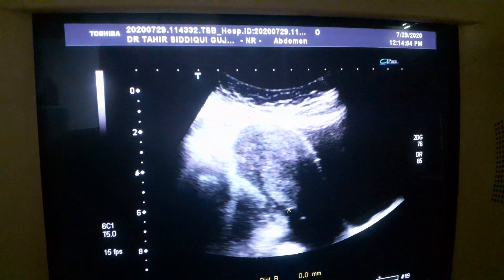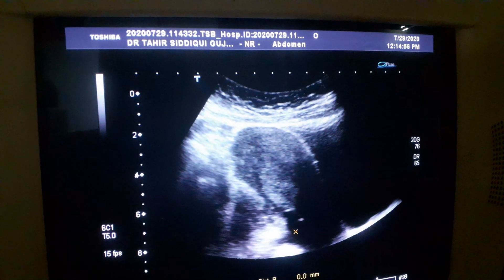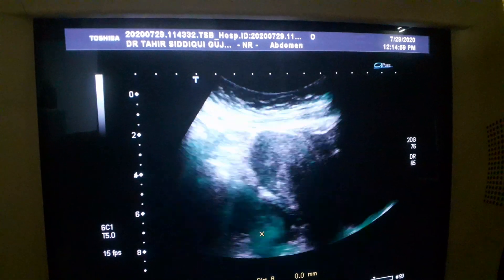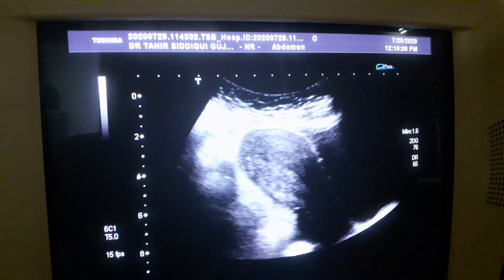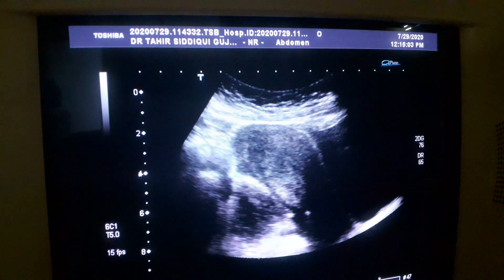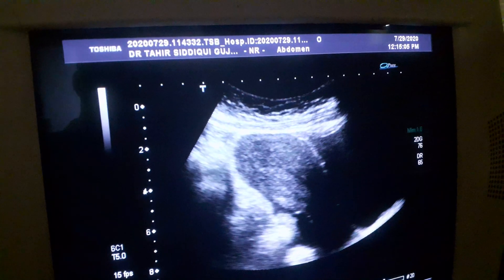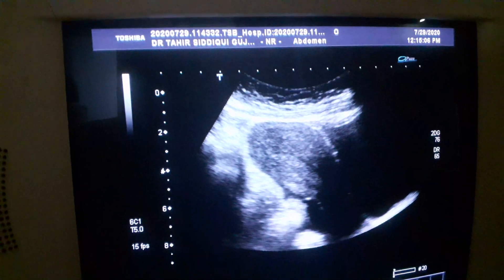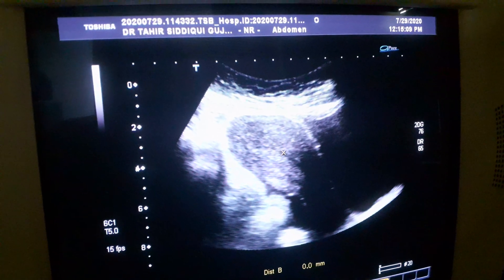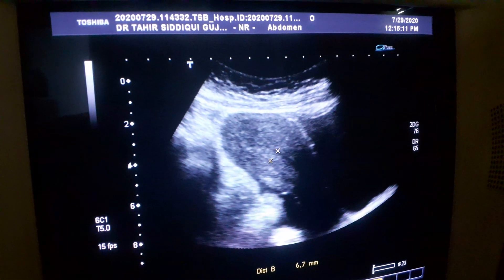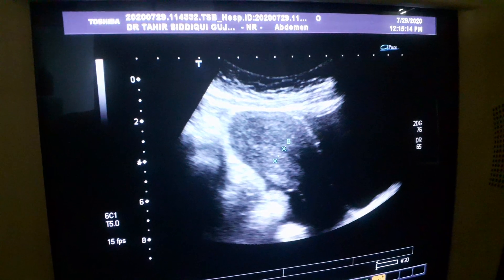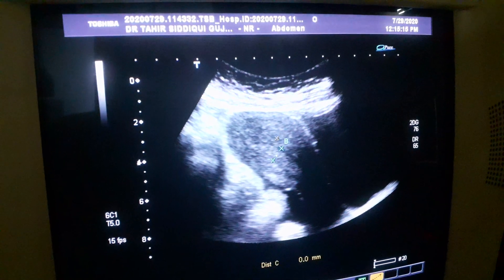This is the uterus in longitudinal section. This is a small amount of fluid seen posteriorly. This is the endometrial canal. The endometrial canal is normal, central and clear.